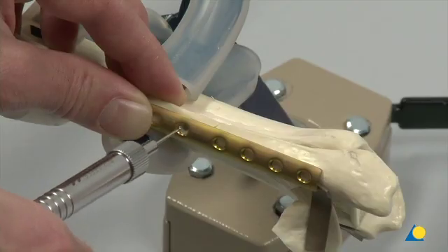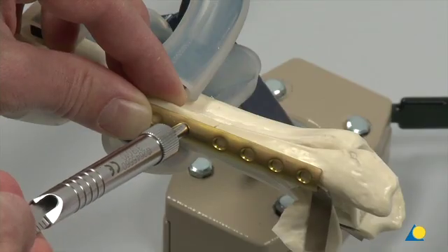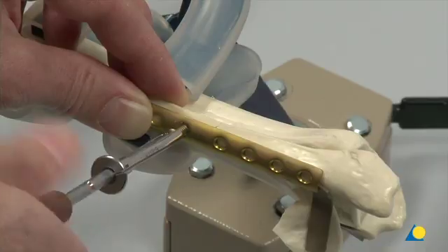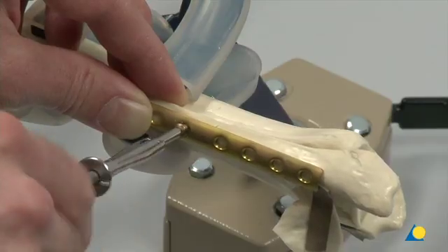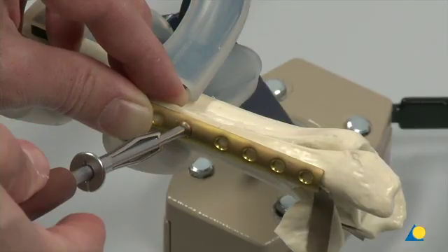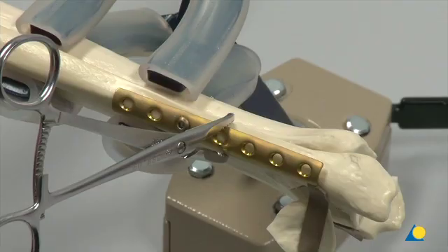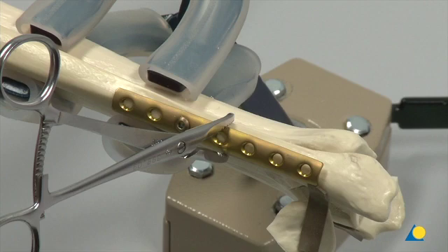The required length of the screw is measured with the depth gauge. The 3.5 mm self-tapping cortex screw is selected and inserted using the hexagonal screwdriver. A final fracture reduction is performed over the plate using the toothed reduction forceps. Clinically, pointed reduction forceps can also be used from a medial-lateral direction, however this requires more soft tissue dissection.